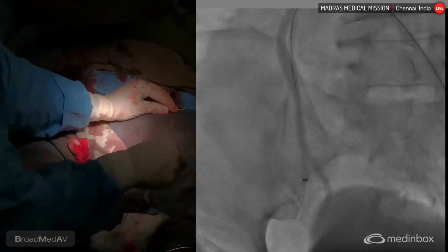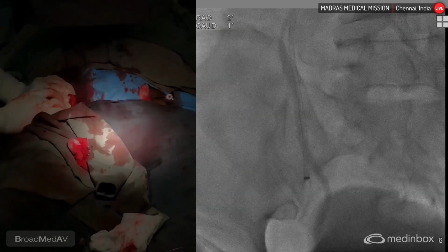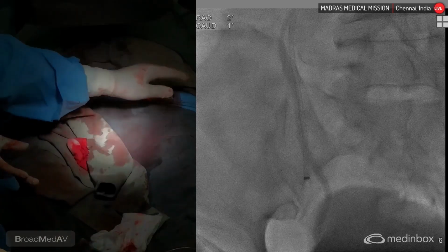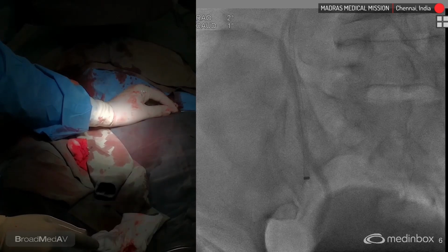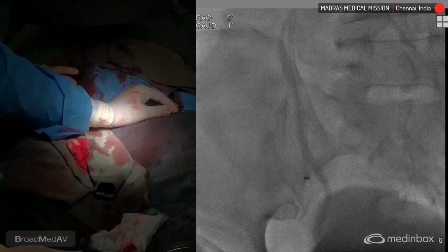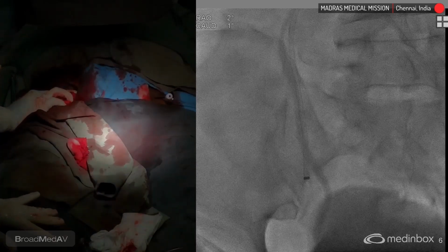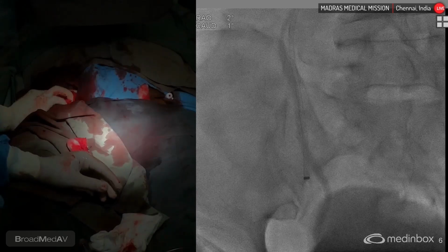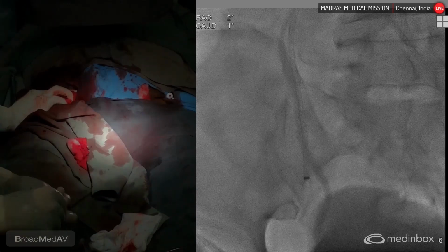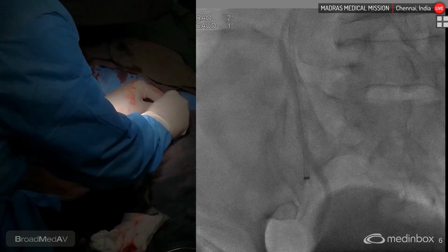Why did you remove the wire? Is he getting awake or what? Because pressure is increasing, pain.